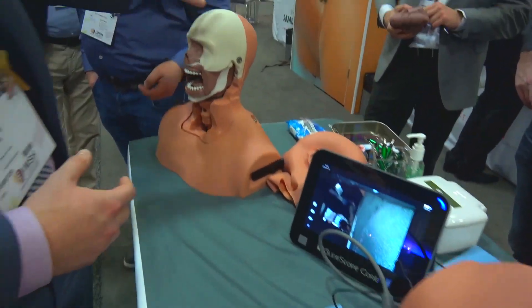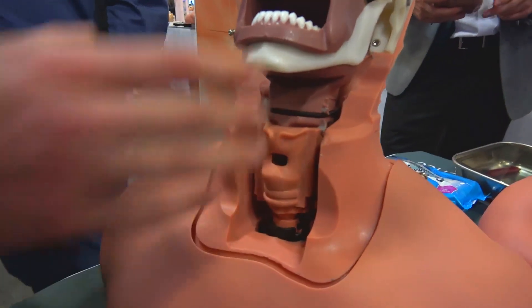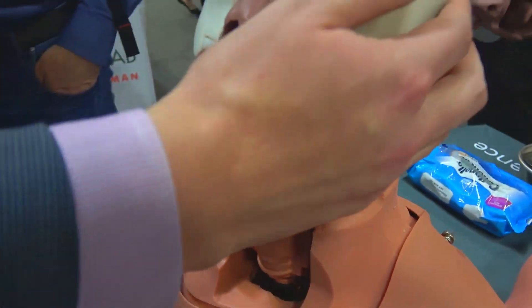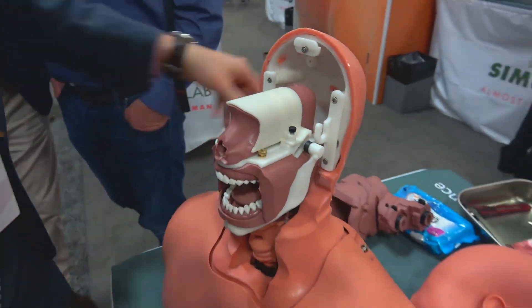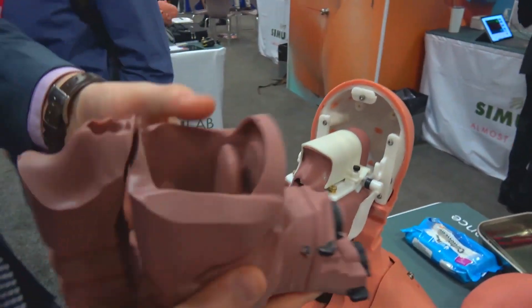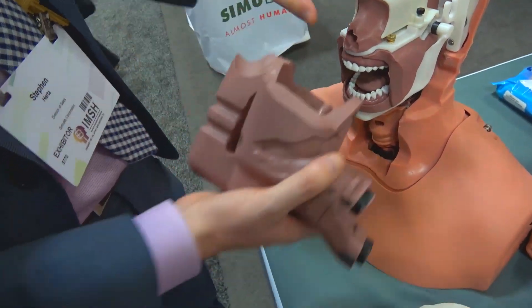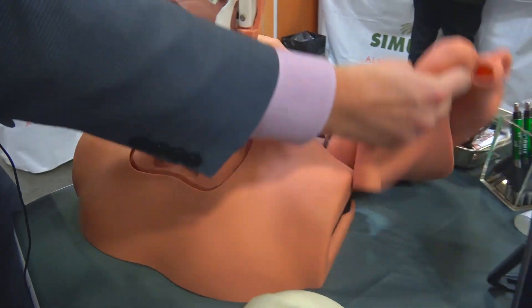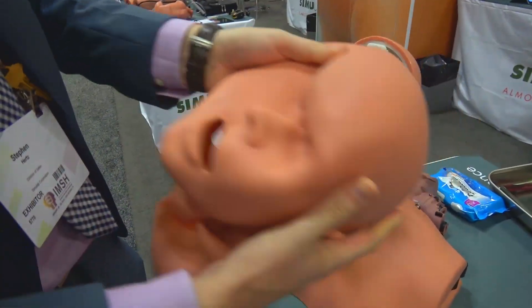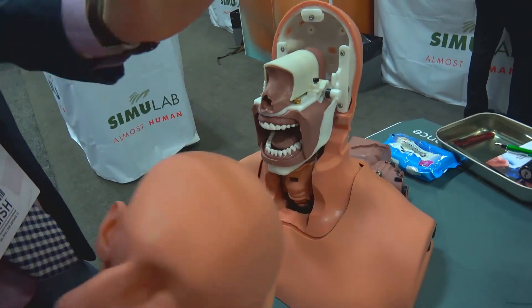If we look over here, we actually have the face off and the inside of the Airway Man system. You can see how this is a very easy system to interchange parts — we could take this off and interchange our airway if something goes wrong, or we can add difficulties and interchange the airway back and forth. Same with the face — it can all be interchanged right there during your course, during your training, easily within five minutes.